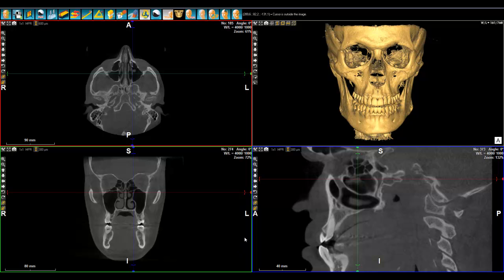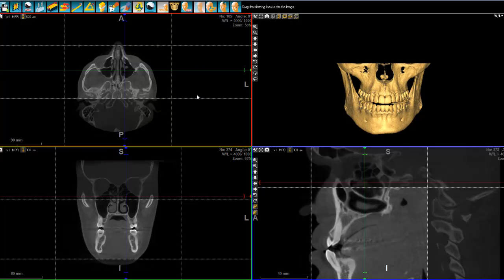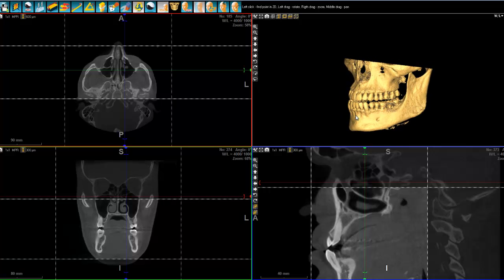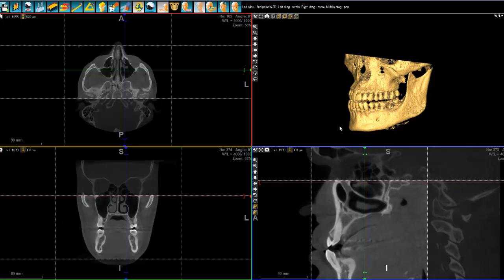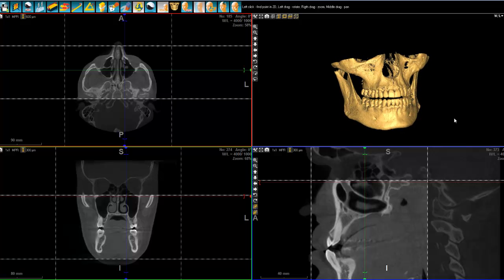This is in general very simple, because you first need to define exactly what area you want to export. Here I've focused on the mandibular region, though I think I could raise it a little bit just to be sure I'm encompassing everything — yes, this would be the good one.